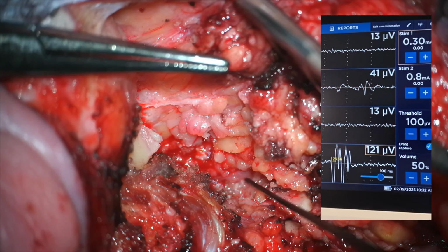Keep going. Okay. Right. So that's a 0.3. Yeah. All right. Ready? And you see there's activation, especially on the lower end. See? Yeah. So we know that the marginal mandibular is there. Where exactly are you pointing? Can you show me? Let me just record that, all right? Upper. Just record it. And then upper. All right.